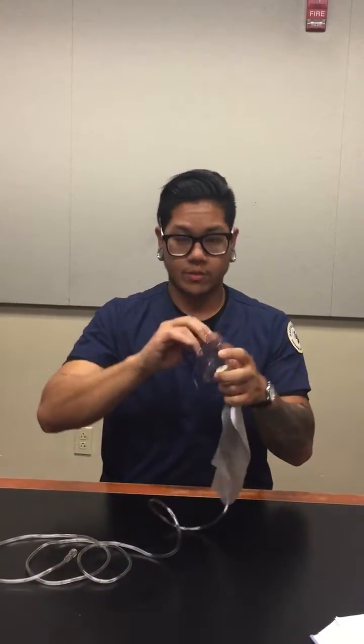Patients can vomit on it and choke, and they need to remove it to eat, and also they have potential to suffocate. And this is best used for emergency patients, short-term therapy that requires moderate to high FiO2. Okay, so I'm going to demonstrate how to use it.